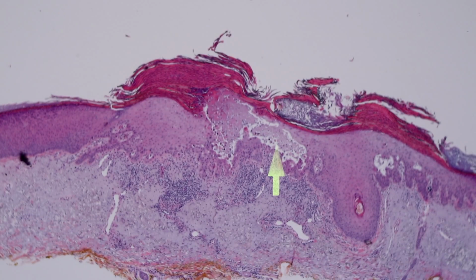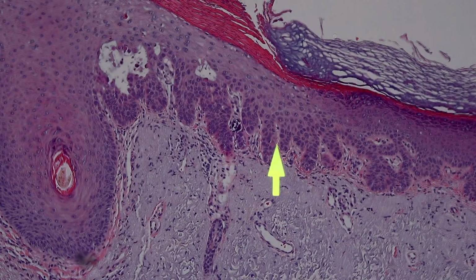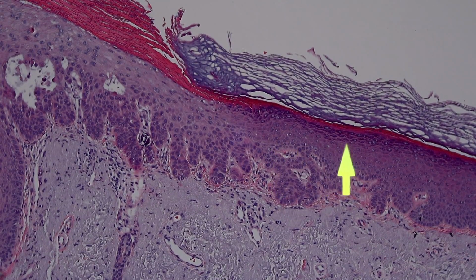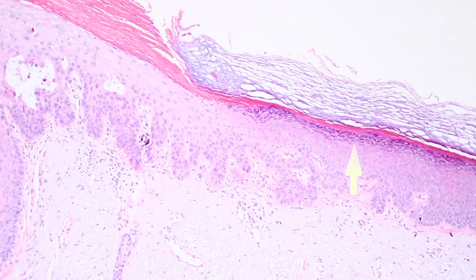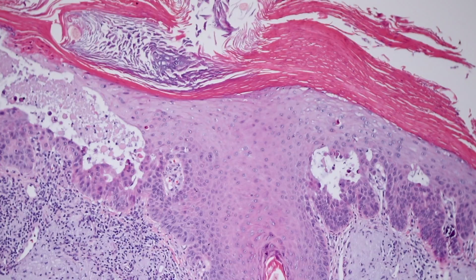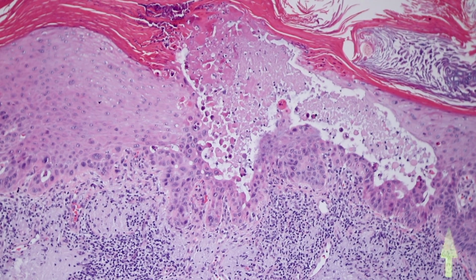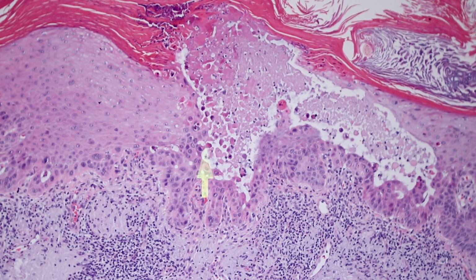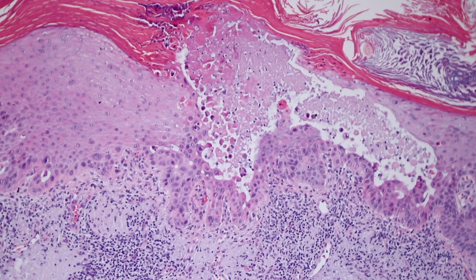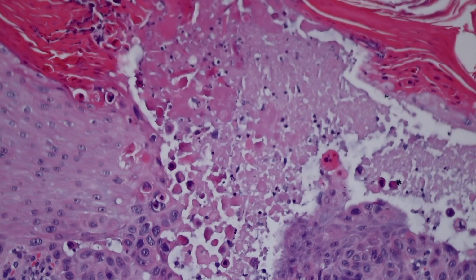All right, some other variants here. Here's an actinic keratosis. Again, kind of lichenified, reactive change over here at the side. And then here's the hypertrophic AK. And then something kind of special happens in this one. The cells all start to fall apart. You've still got that layer of atypia along the base, jumbled and hypercellular. But then here the cells are rounding up and getting very bright pink and falling apart. So this is acantholysis. And I would regard this as an acantholytic actinic keratosis.